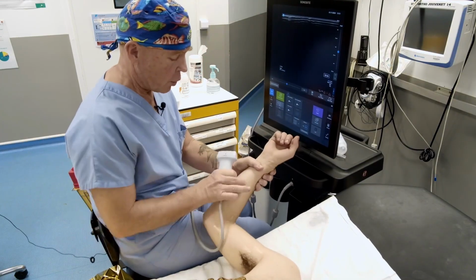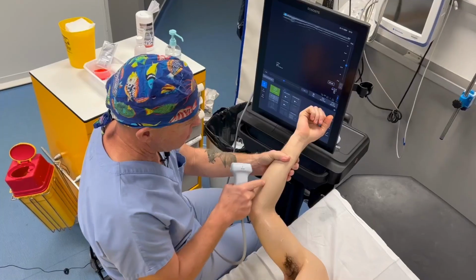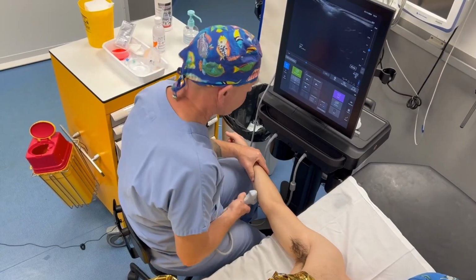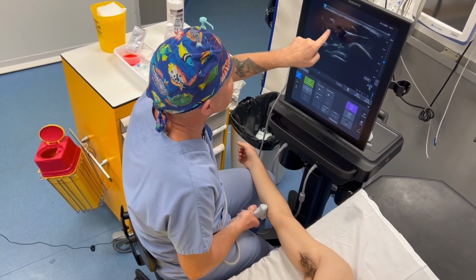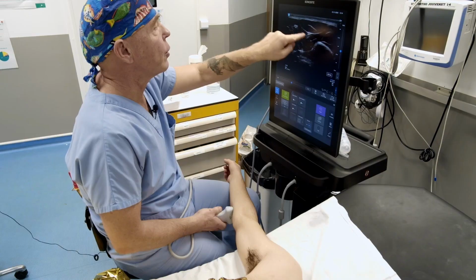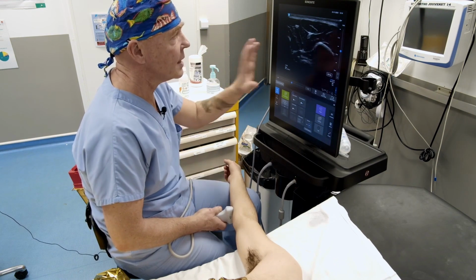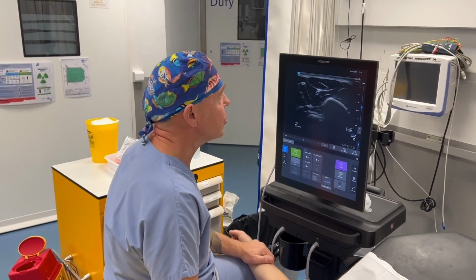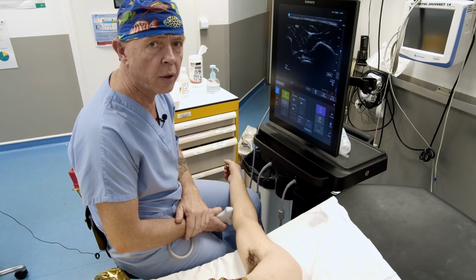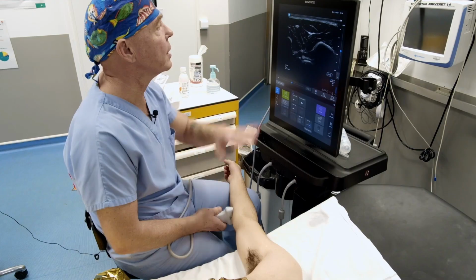So I told you about this big muscle here, the FCU, okay? So you position yourself a little bit at a good spot. 9 to 10 centimeters here, okay? And then you place your probe like this, and as you can see, we find exactly the same image as earlier. All right, you just need to enhance it with the ulnar nerve, which is at the top. So this is actually quite common. It's almost always the case. With this image, there are very few anatomical variations at this level, and it allows you to achieve a 100% success rate with your blocks, sorry. There you go.